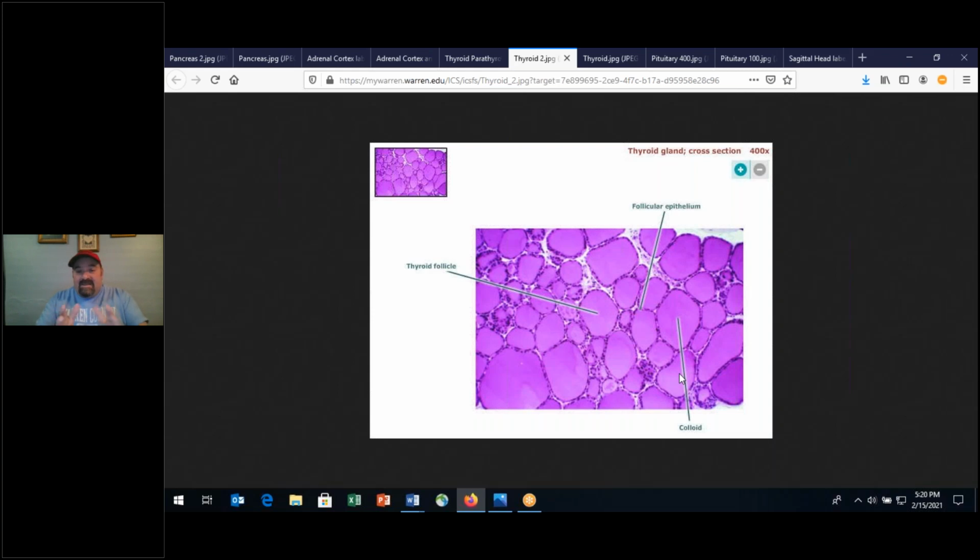released. Thyroid gland, highly vascular, right? Highly vascular, because thyroid hormone is a major metabolic hormone. If we have too much of it, your body's jacked up. If we have too little of it, it's like you're running in slow motion. So really, thyroid hormone is a major metabolic hormone. We'll discuss that in more detail, but if you just look at this image right here, very distinct from the other tissues. Thyroid gland, thyroid tissue.